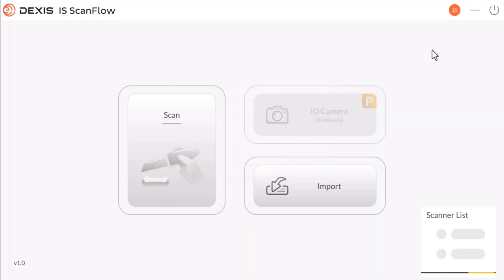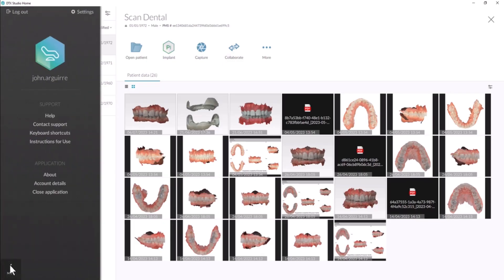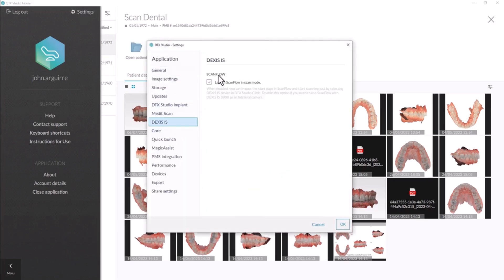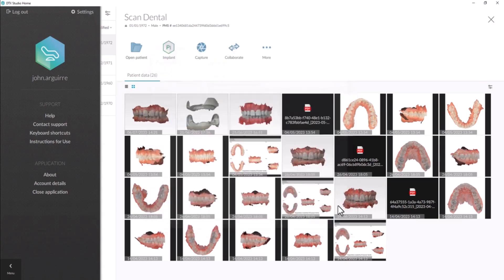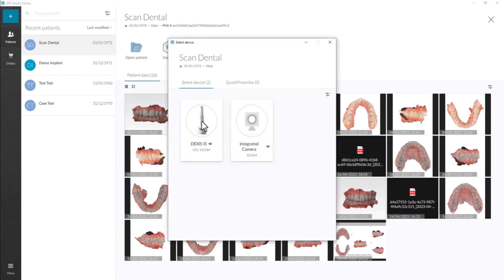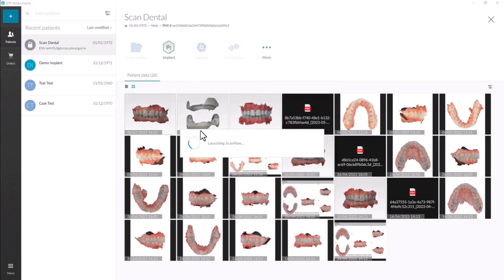If the import window does not display after clicking Capture, the Launch ScanFlow in Scan Mode is checked. Go to the Menu option, click Menu, then Settings, click DEXIS IS, uncheck and click OK. In the imaging software, open the patient's file. Click the Capture icon, then select Device to launch the IS ScanFlow window.